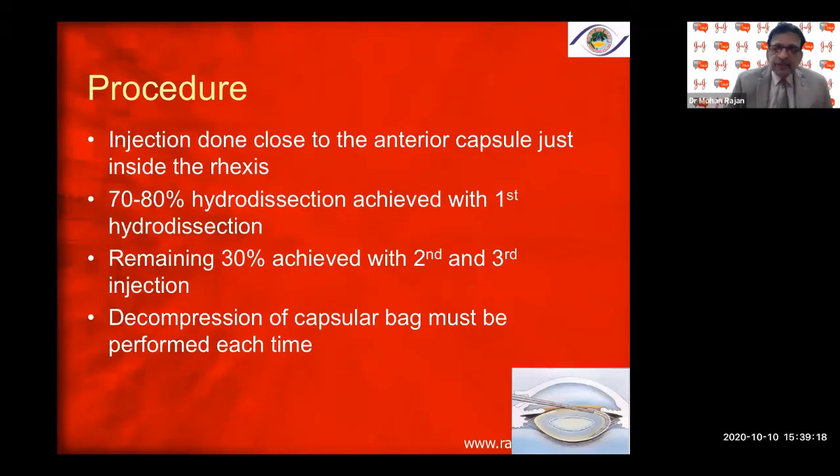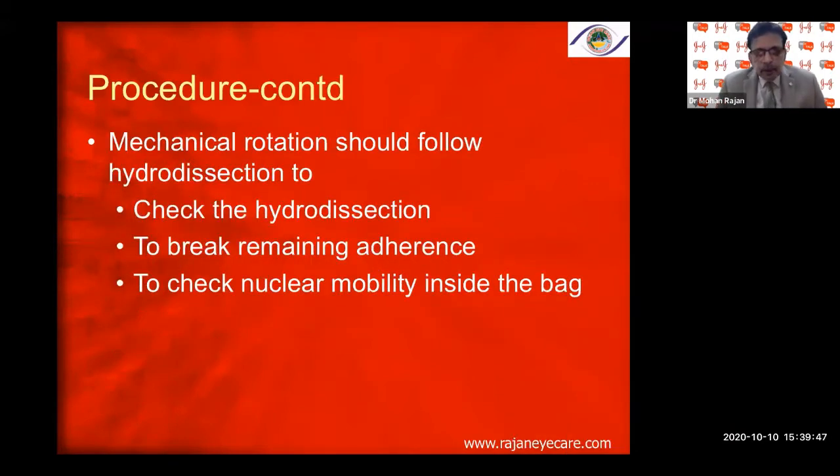Decompression of the capsular bag is performed each time to prevent acute capsular blowout syndrome and hydro-rupture — you don't want fluid accumulating between the nucleus and the posterior capsule and inflating it. Every time you do a hydrodissection and see a wave, decompress or push the nucleus back into the bag, then go for the second and third injections. Mechanical rotation should follow hydrodissection to break remaining adherences and check nuclear mobility.